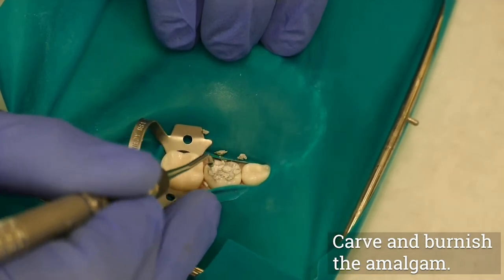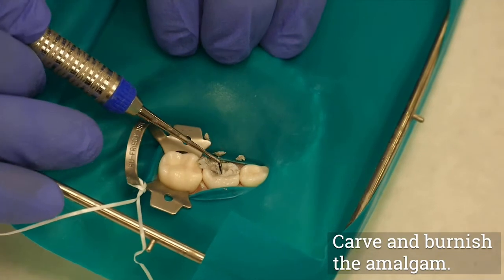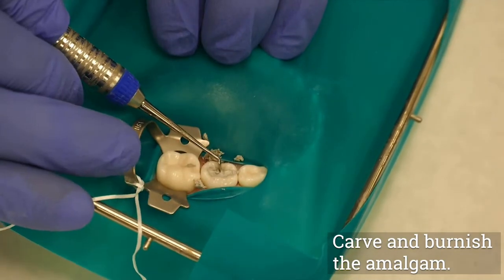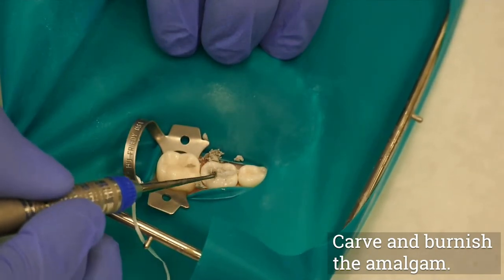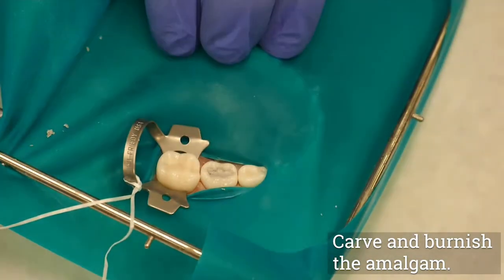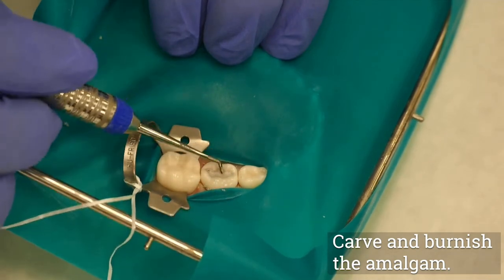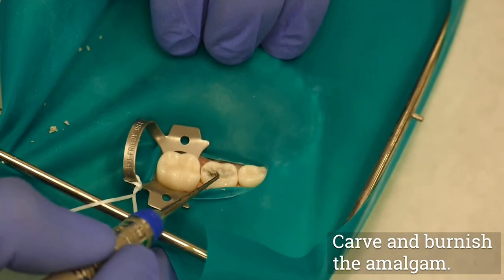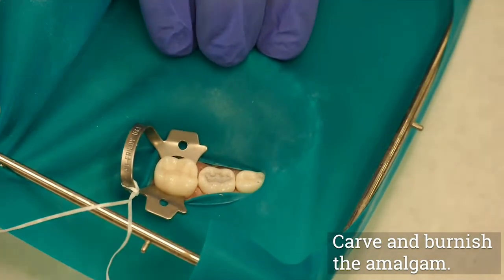Following condensation, use a ball burnisher to begin initial contouring by pushing the excess amalgam up and away from the margins. Use a small cleoid discoid for carving primary restorations. Always keep part of the carving edge of the instrument on the tooth structure to remove flash and maintain marginal integrity. Keep anatomy in primary molars shallow to avoid weakening the restoration. Creating a thin shelf of amalgam at the cavosurface margin and reducing the bulk of amalgam in the central stress-bearing areas can both lead to fracture.